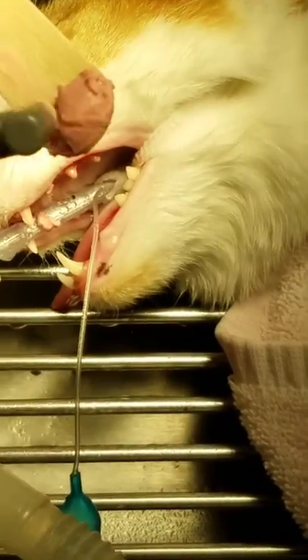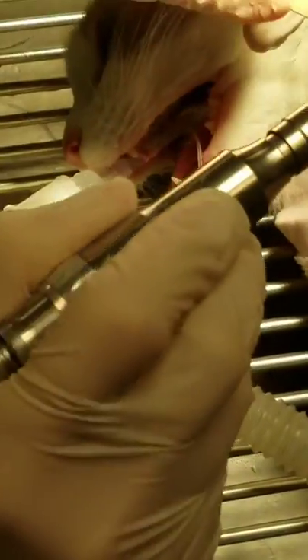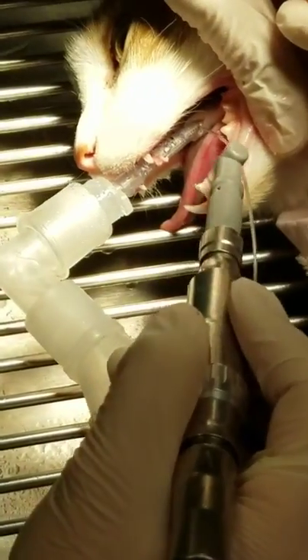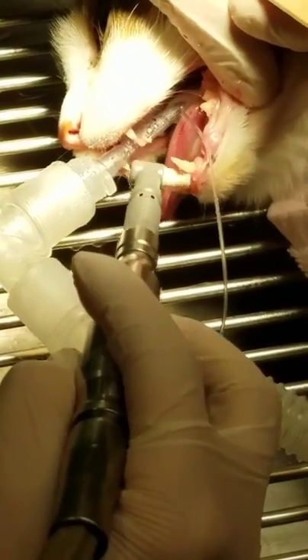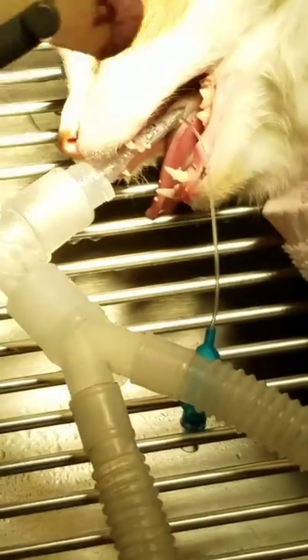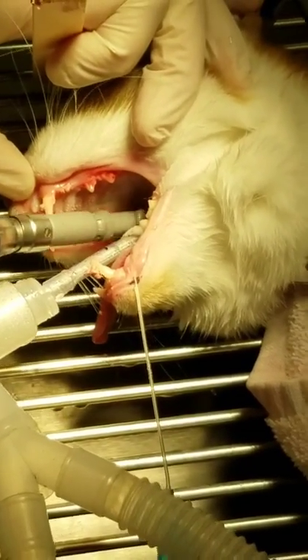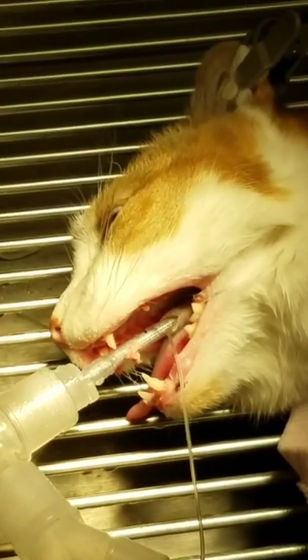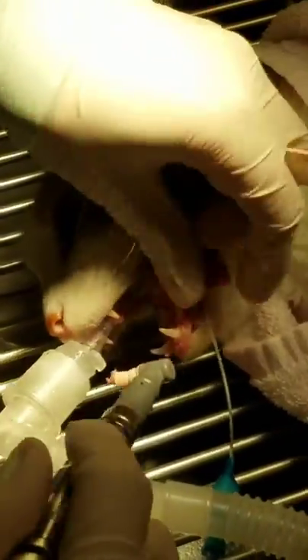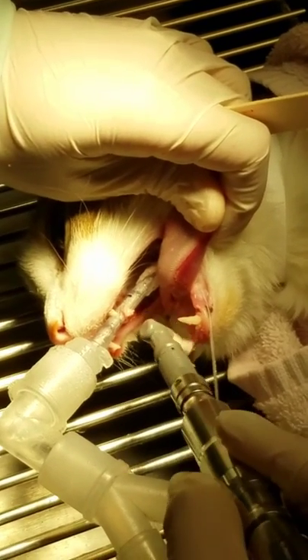So this cat is getting what now? We are doing dental radiographs. It's not terrible so far from what I see. He's got on his estimate for two major extractions. Are you going to use the laser? We will, yeah. I am very methodical about taking my dental rads as well. That's great. I need to learn how to do them right.